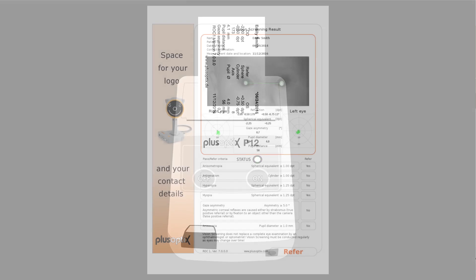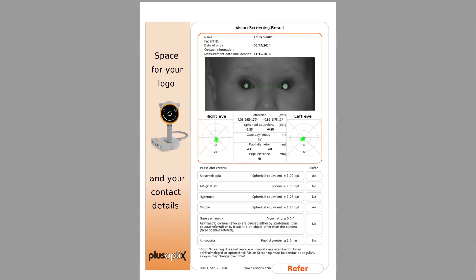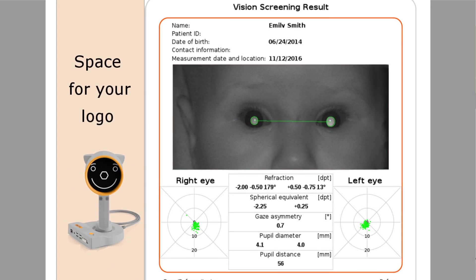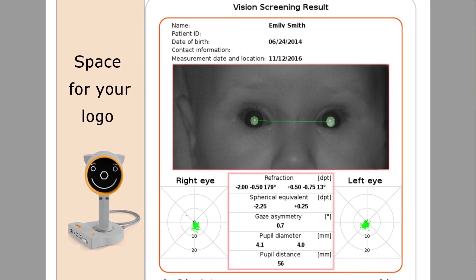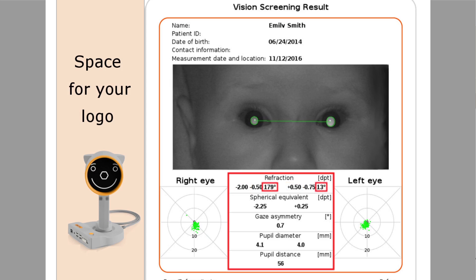The measurement report saved on the USB stick shows the image of the last measurement as well as the measurement values. The sphere, axis, and pupillary distance are additionally displayed in all printouts and in the patient database.